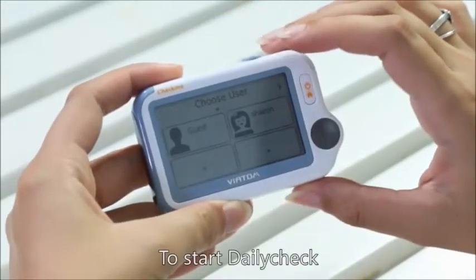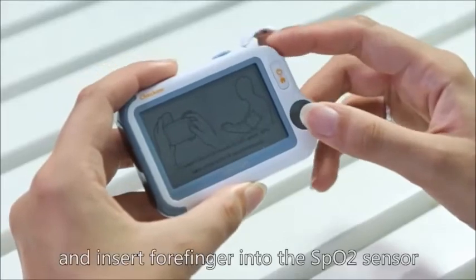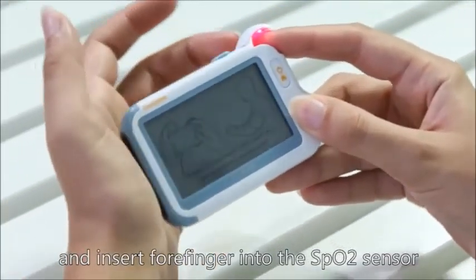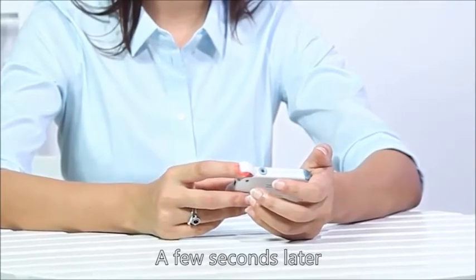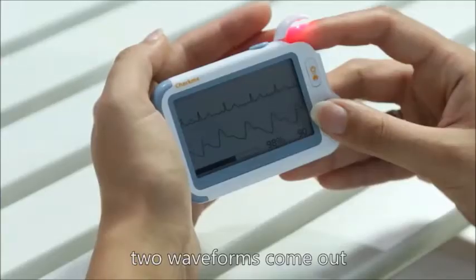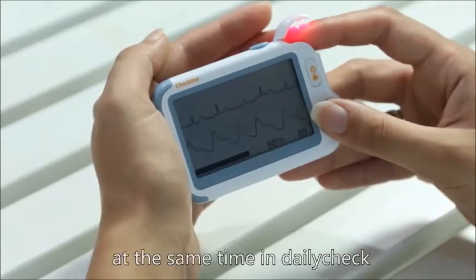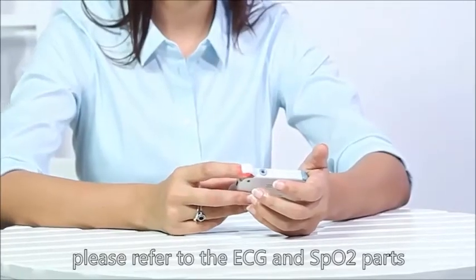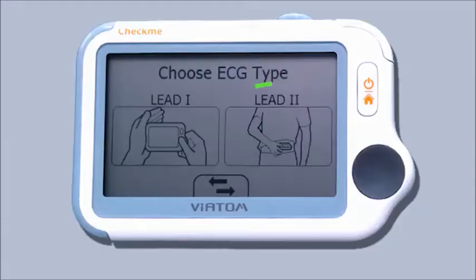To start daily check, choose the right user first. Hold the electrodes gently and insert your forefinger into the SpO2 sensor. Rest your hands on a table. A few seconds later, two waveforms come out. As you need to test ECG and SpO2 both at the same time in daily check, please refer to the ECG and SpO2 part for specific requirements.